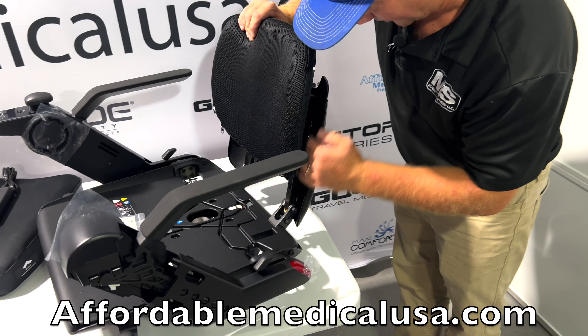It doesn't have a swivel, but the armrests are removable for transferring on both sides. Make sure you charge this up overnight before you use it. You can do your Bluetooth and bring the chair to you. These are the Opni wheels — see how nicely it moves. It's got lights and it actually talks to you. So let's say you have it in free-wheel mode — it will say the brake release lever is undone, so turn it off and turn it back on. It's pretty nice.